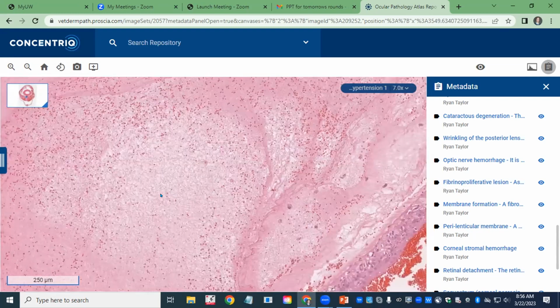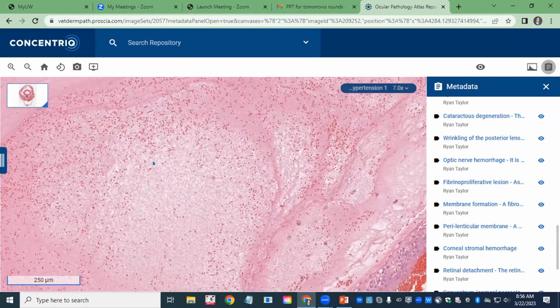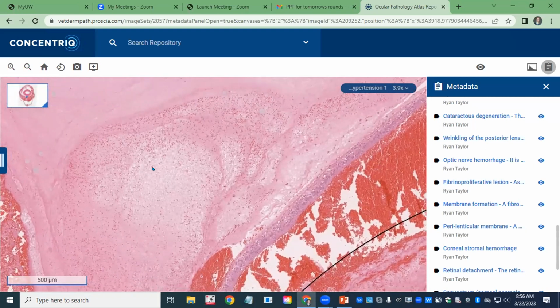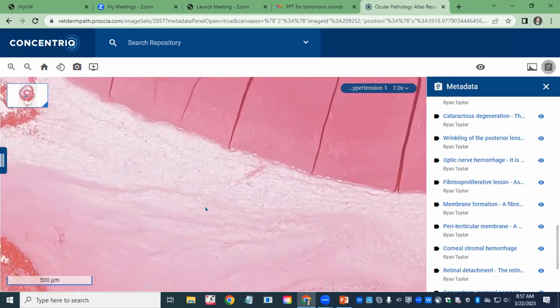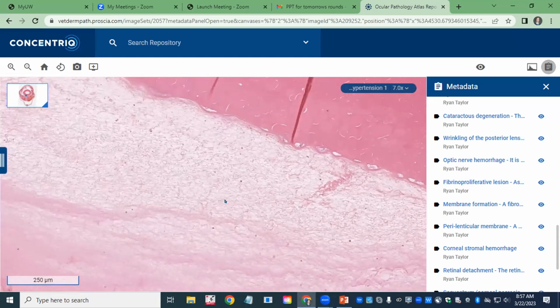Okay, so here's a good example. There's a lot of fibrin in here, which is kind of clouding our interpretation, but you see the hemorrhage, and then you see this lightly eosinophilic background. This is a serum that's less densely proteinaceous and more like regular serum, I suppose you could say, in contrast to what we have with hyperviscosity syndrome, where it's really, really bright and magenta.